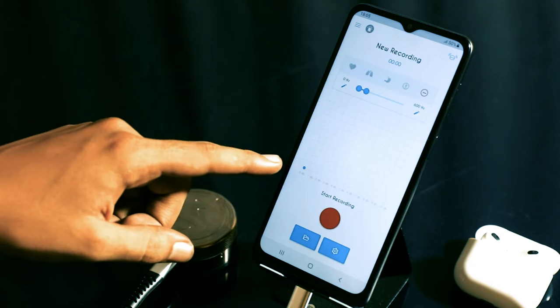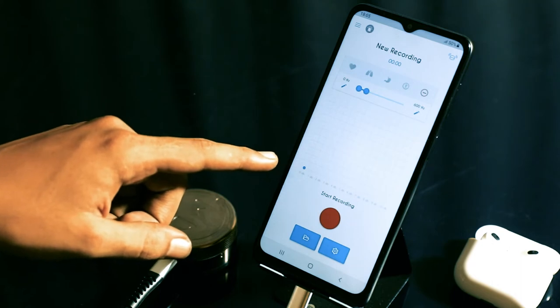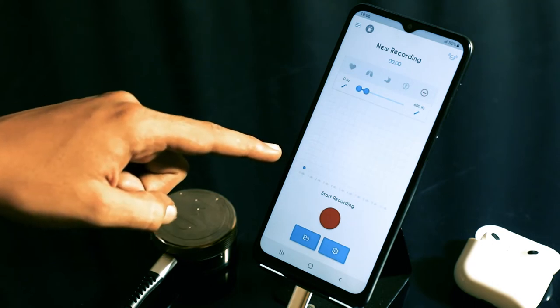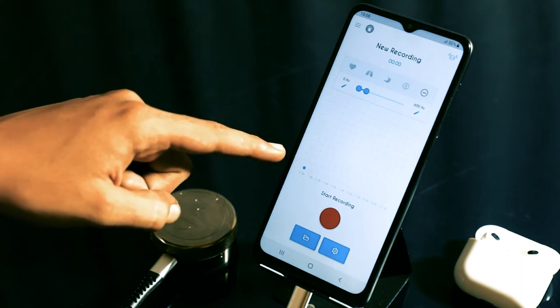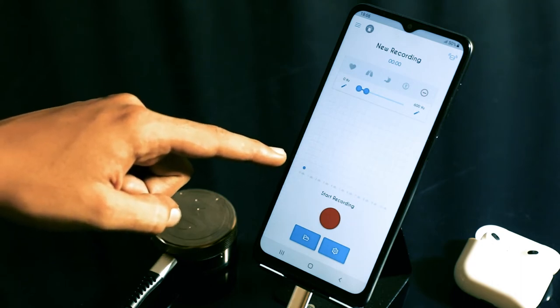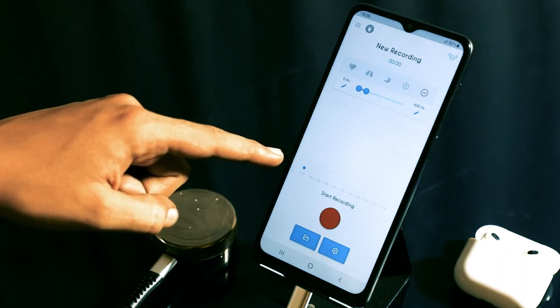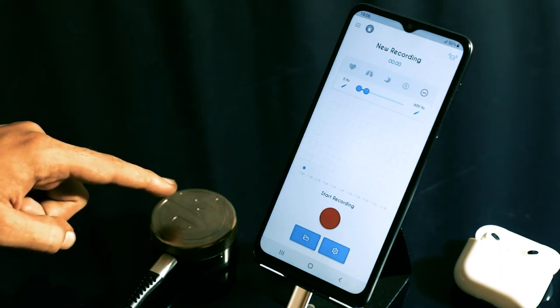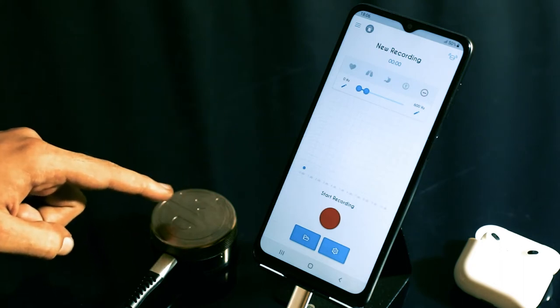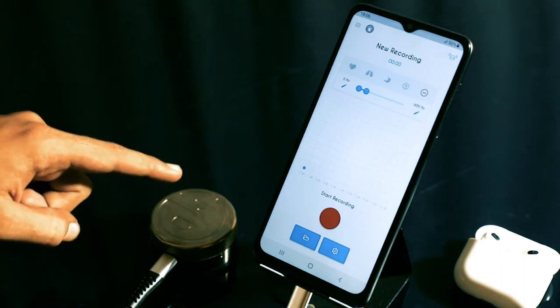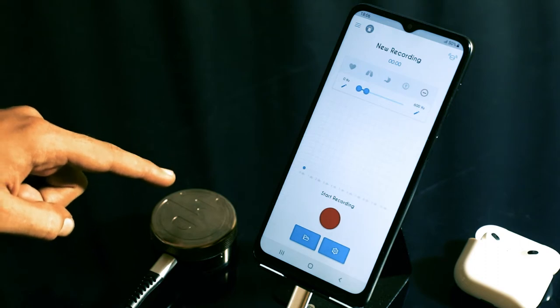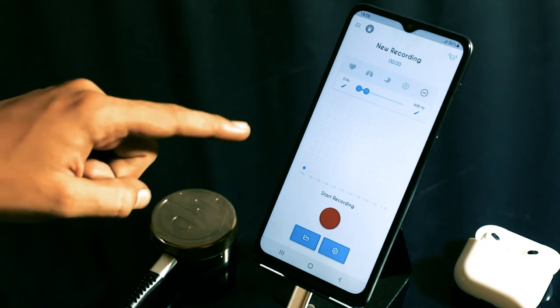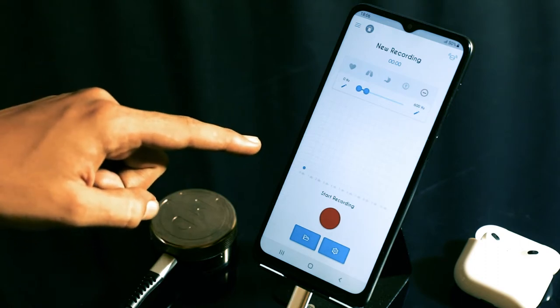Right below is the amplification menu. This blue dot helps you increase the volume of the sound coming in from the Tal digital stethoscope. Please note that this is the volume of the sound coming in from the stethoscope and not your mobile's volume.